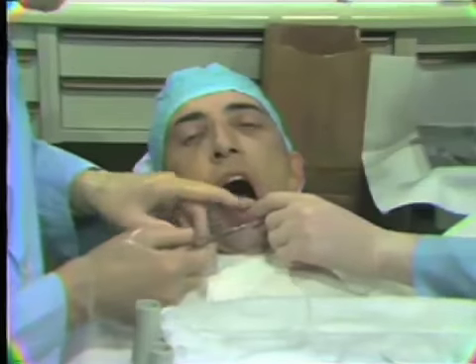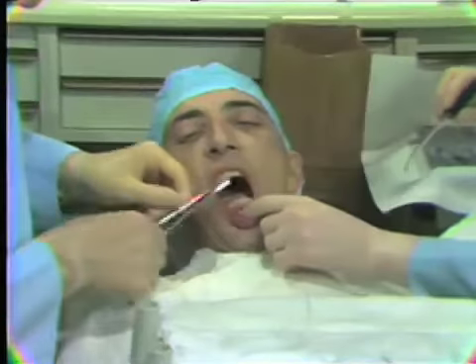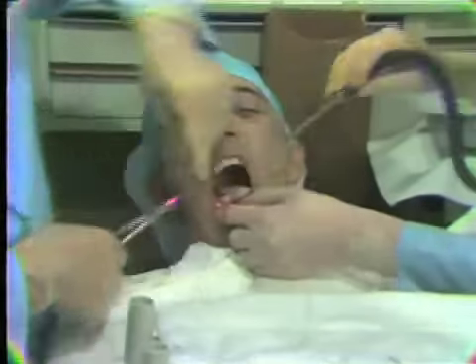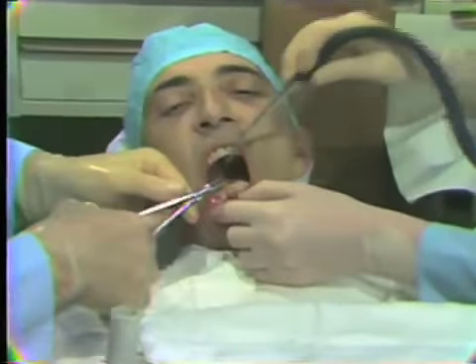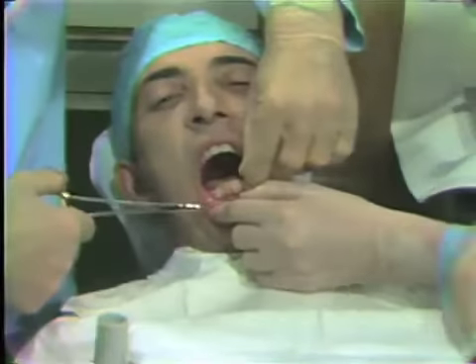We are nearing completion of the placement of the sutures at this point. As you note, the assistant continues to retract the lip as necessary so that we have a clear view of the tightness of our suture.